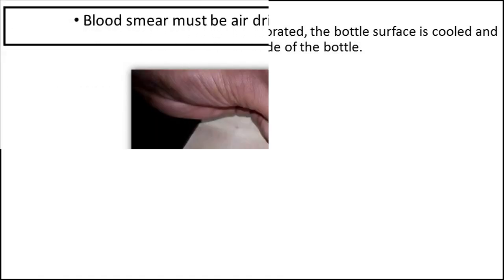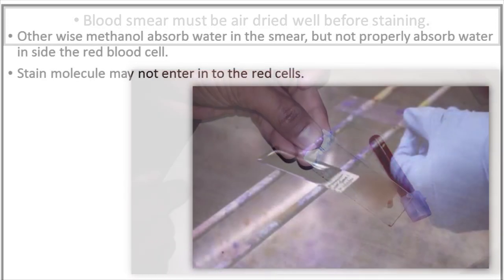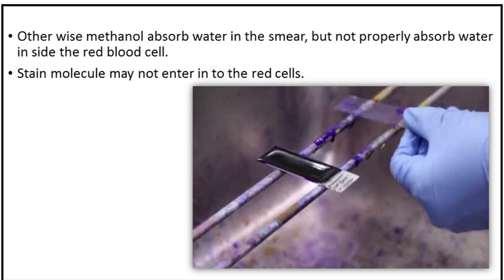Blood smear must be air dried well before staining. Otherwise, methanol absorbs water in the smear but not properly inside the red blood cells. Because of that, stain molecules may not enter into the red cells.